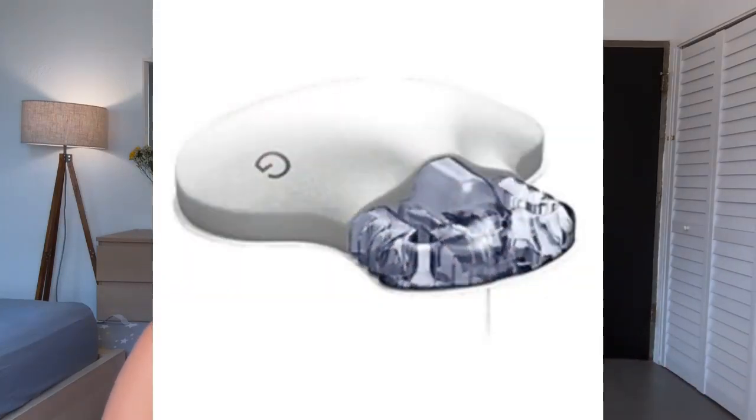Also, it will give you a visual of your nighttime blood sugars as well as a commentary that can help you assess whether or not you need to adjust your nighttime insulin. If you have a Medtronic CGM, you can see your blood sugar readings in real time in the InPen app. If you have a Dexcom CGM like I do, there is a few hours delay. Reason for that is that InPen is a Medtronic product and Medtronic doesn't play super well with others.